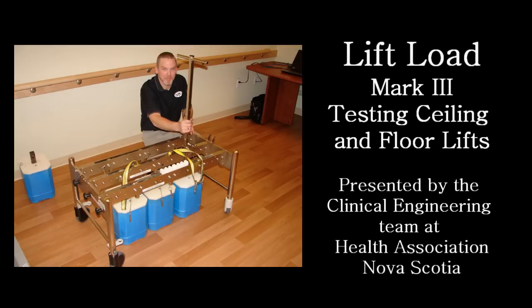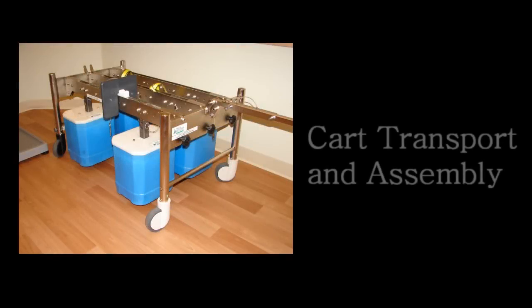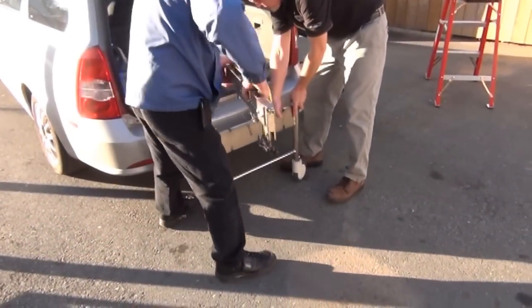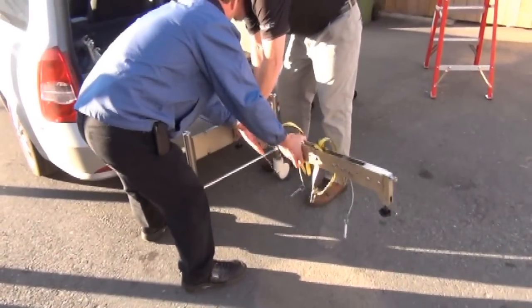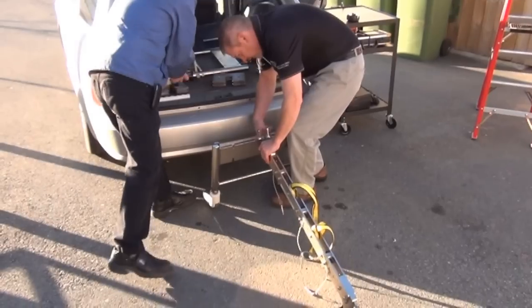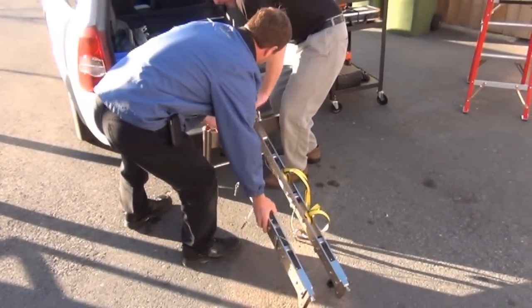The Lift Load Mk3 is a patient lift testing load, which has been designed so the operator does not have to lift any component that weighs more than 20 pounds. The bulk of the weight is left on site at each facility where routine testing takes place. The operator only needs to carry a minimal amount of equipment to each facility. The lift load can be transported in a small car and assembled on site.